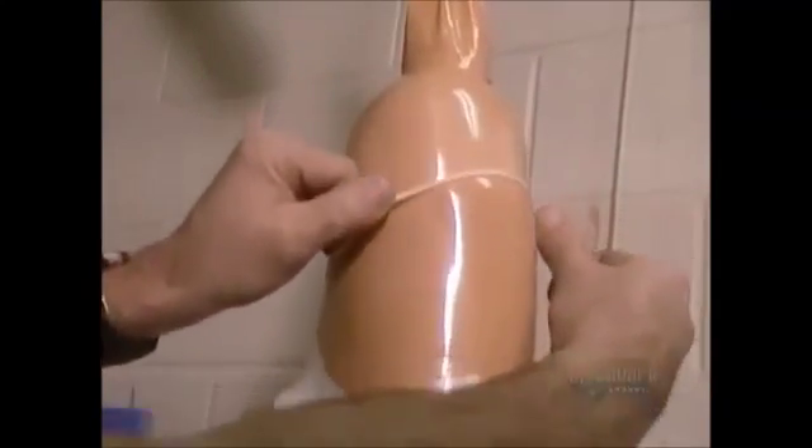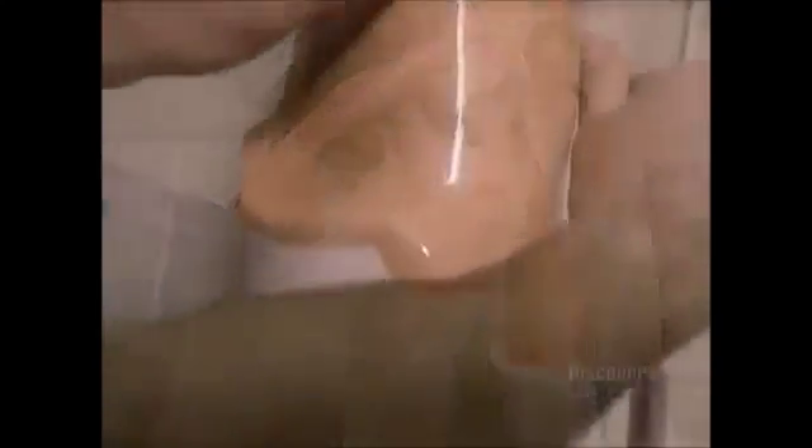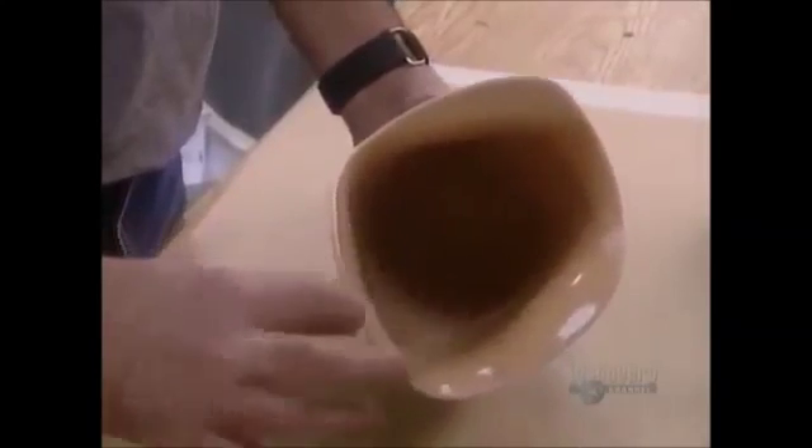The acrylic solidifies in about an hour; polyester takes about 12 hours. They then break the plaster mold inside, leaving a durable plastic shell called a socket. That will be the basis of the artificial limb.